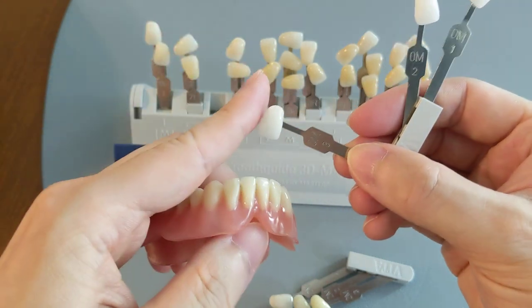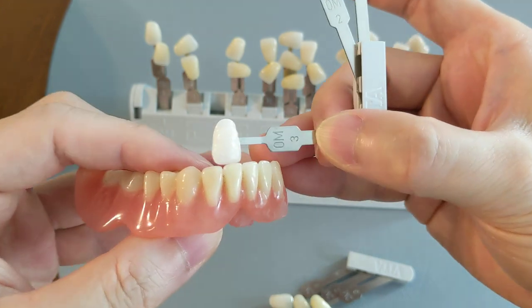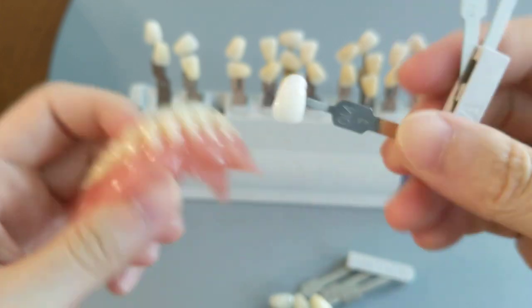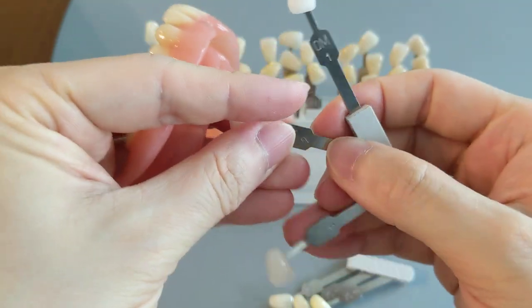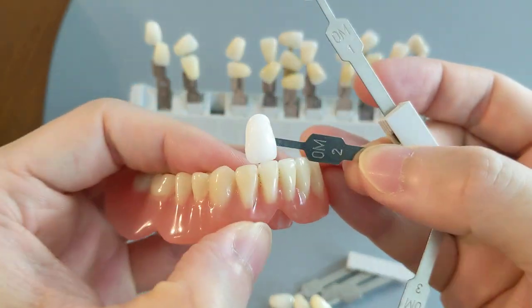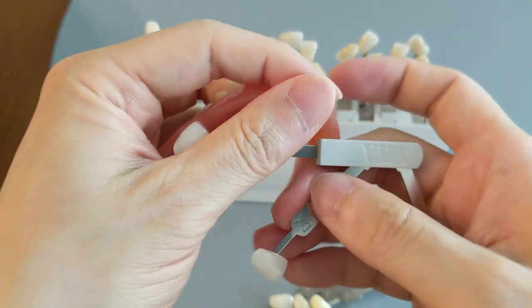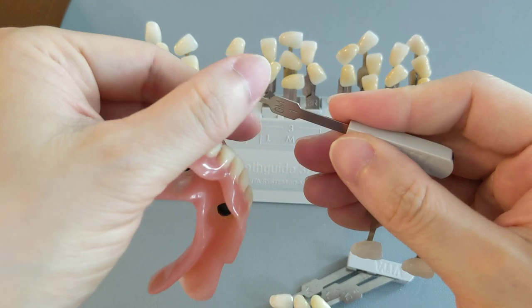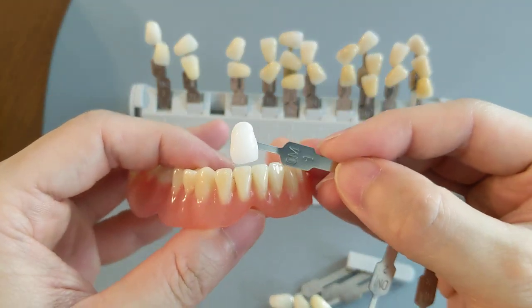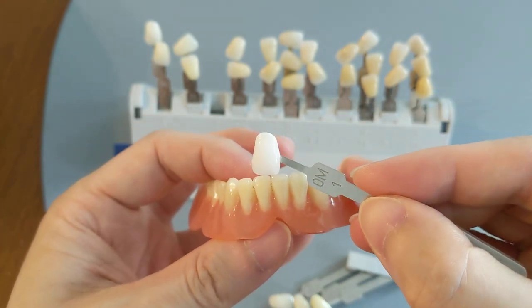I'll show you the 0M3 first — we're going to compare them on top of each other, from slightly different angles so you can see what it looks like. And now we have the 0M2, which is the second whitest bleach shade, and it's still pretty, pretty white. And then we have the 0M1, the whitest denture color — this is the whitest of the whitest. You can't get any whiter than this because there's no yellow in this color at all.